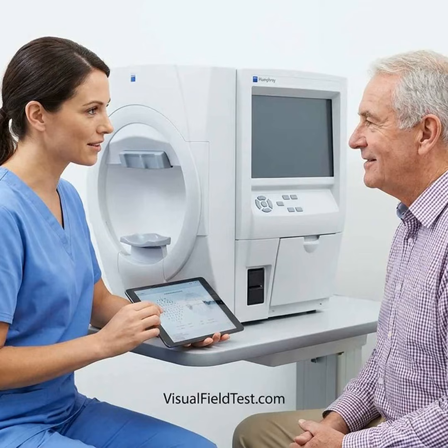Step 6. Use neutral support during testing. The technician should monitor the patient's position, alertness, and fixation without repeatedly giving performance-related comments. Overly frequent prompts may distract the patient or alter responses. A standardized script and consistent technician approach are preferable because technician instructions can influence perimetry results.